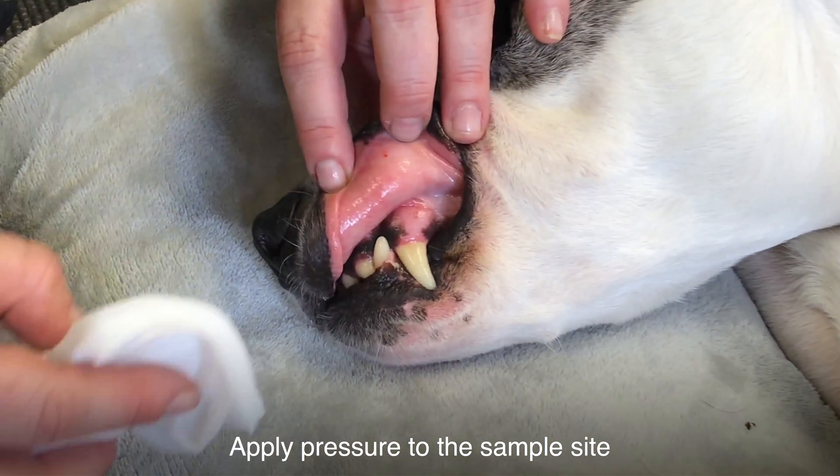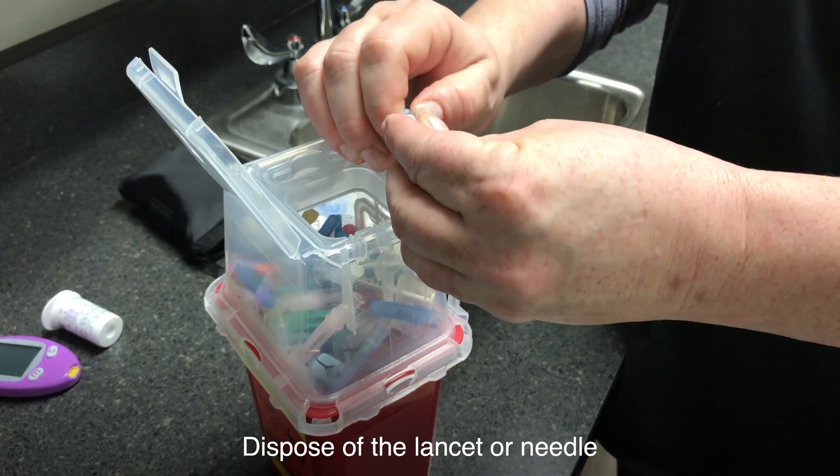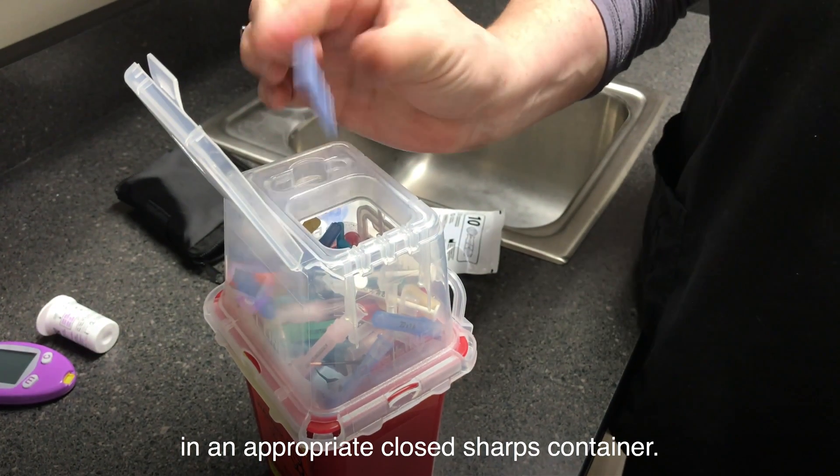Apply pressure to the sample site with a cotton ball or a piece of gauze. Dispose of the lancet or needle in an appropriate closed sharps container.